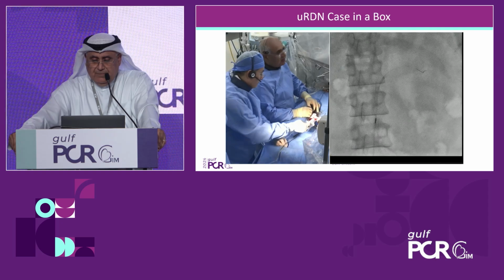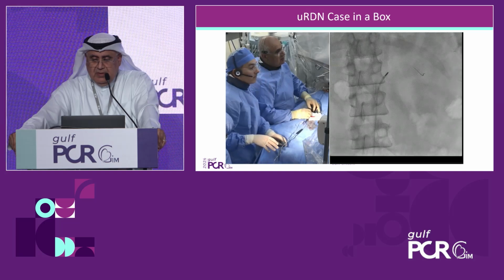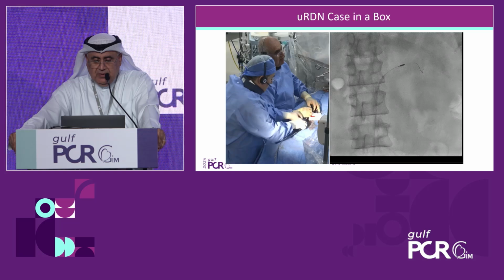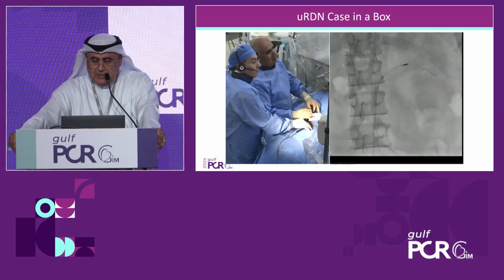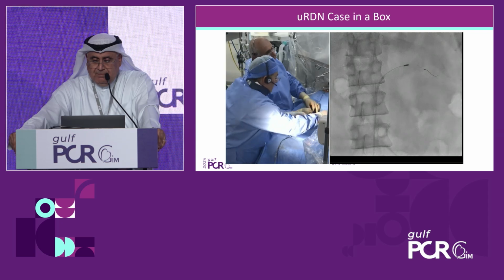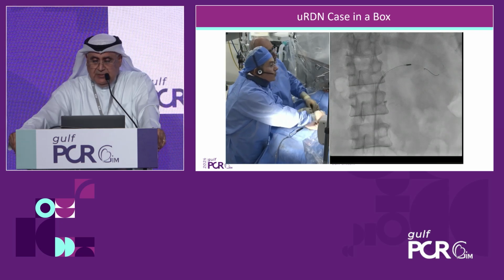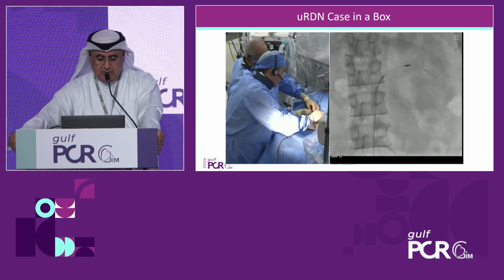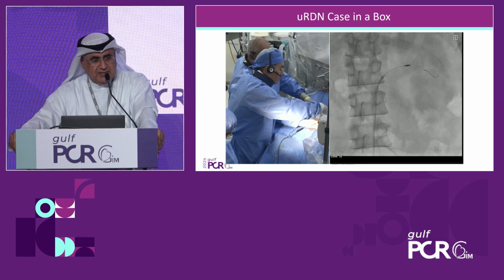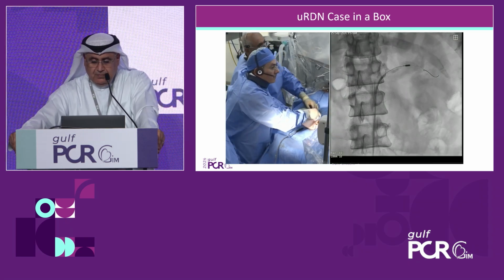So I'm advancing again, as we see on the screen. There was a leakage, so we had to exchange the balloon with another one, a higher balloon, which was a 6. We'll do a small puff, please. That's a challenge with our current technology, that we may have to change multiple balloons. You know, the renal arteries have a really large variety of sizes. So I think this is okay.